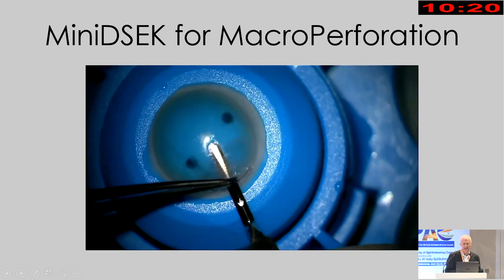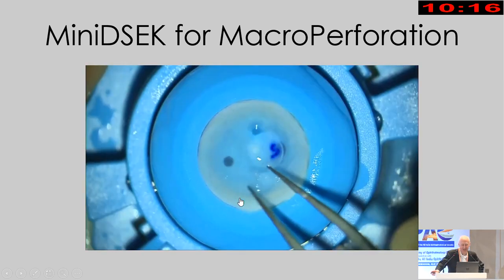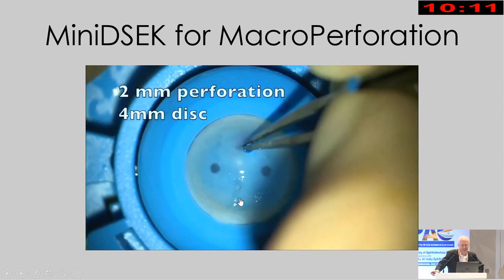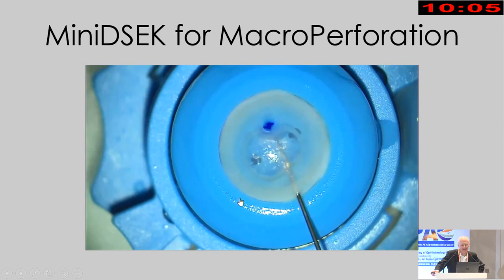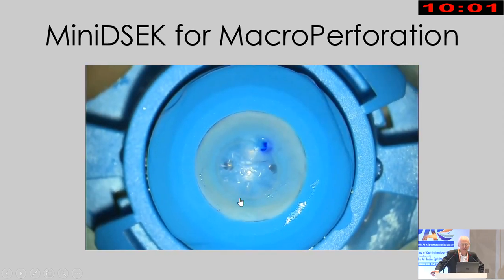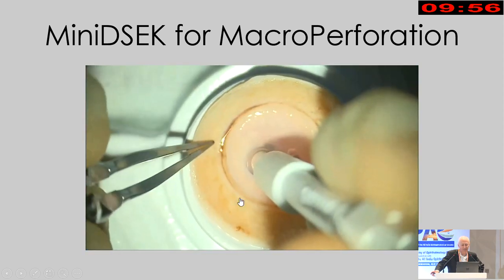And this is a video that my colleague Alfonso Vasquez Perez, a super surgeon who was working with me as a fellow at the time, has put together, and he's taken this forward really nicely. So we mark the DSEC donor out. Here we are in the wet lab, trying out different bursting pressures with different sizes of experimental perforation. You can move this little patch quite easily with a needle over Provisc in the chamber there.